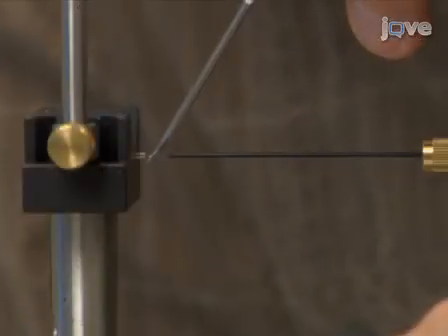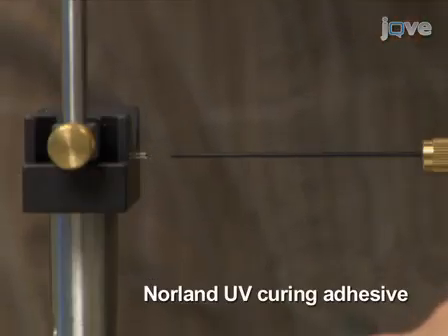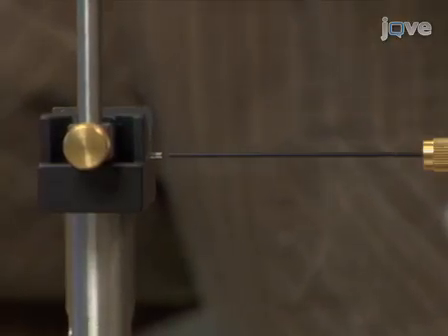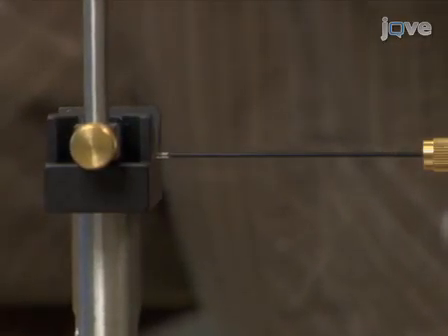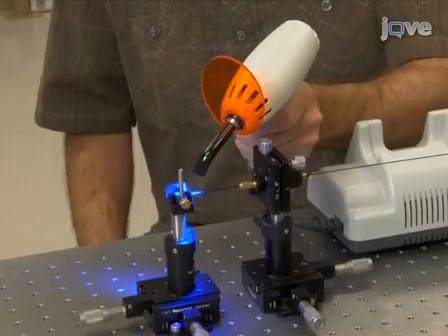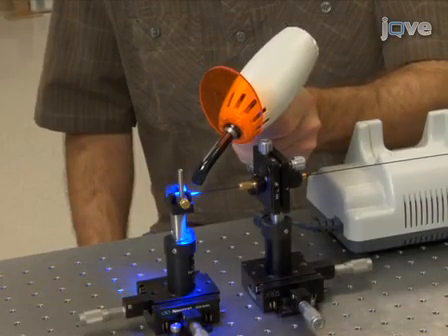Next, place a drop of optical adhesive on either the lens or bundle face. Using the manual positioners, bring the two components into contact. Expose the interface to UV light for the dose recommended by the manufacturer to cure the adhesive.